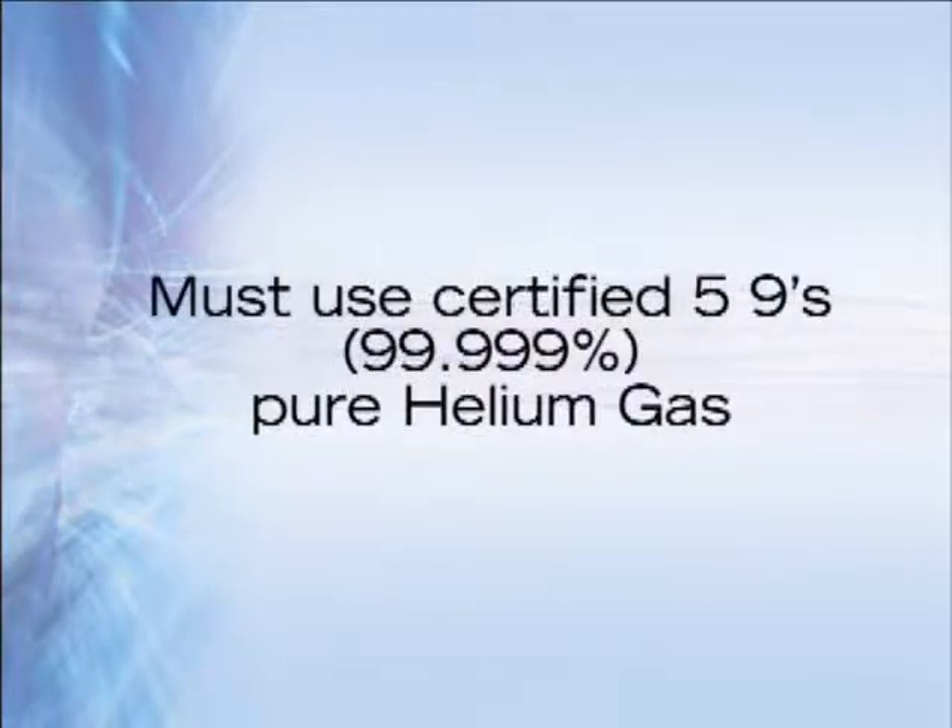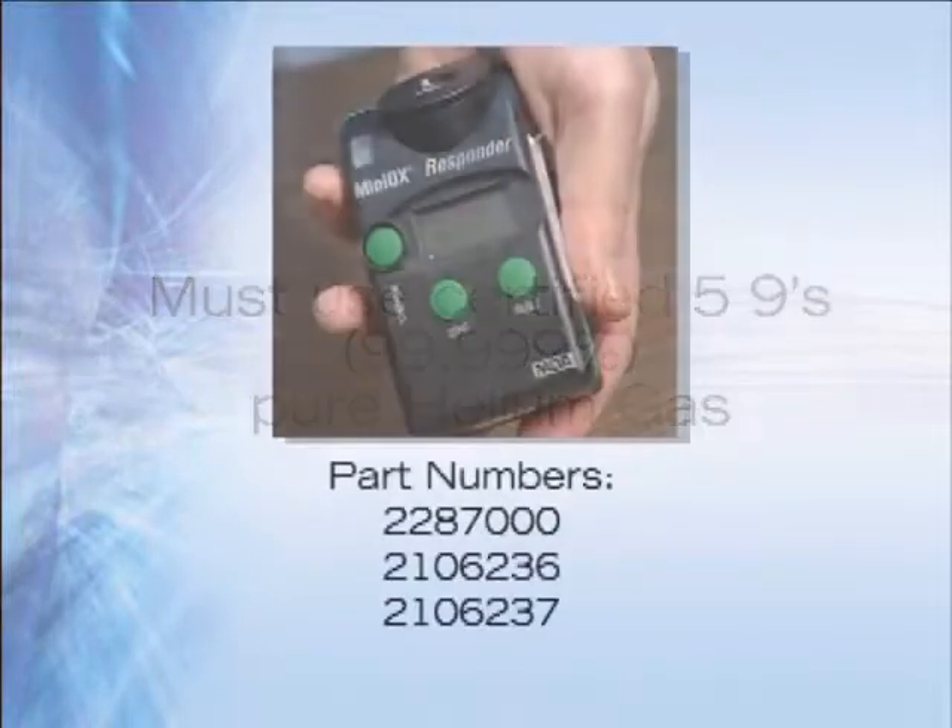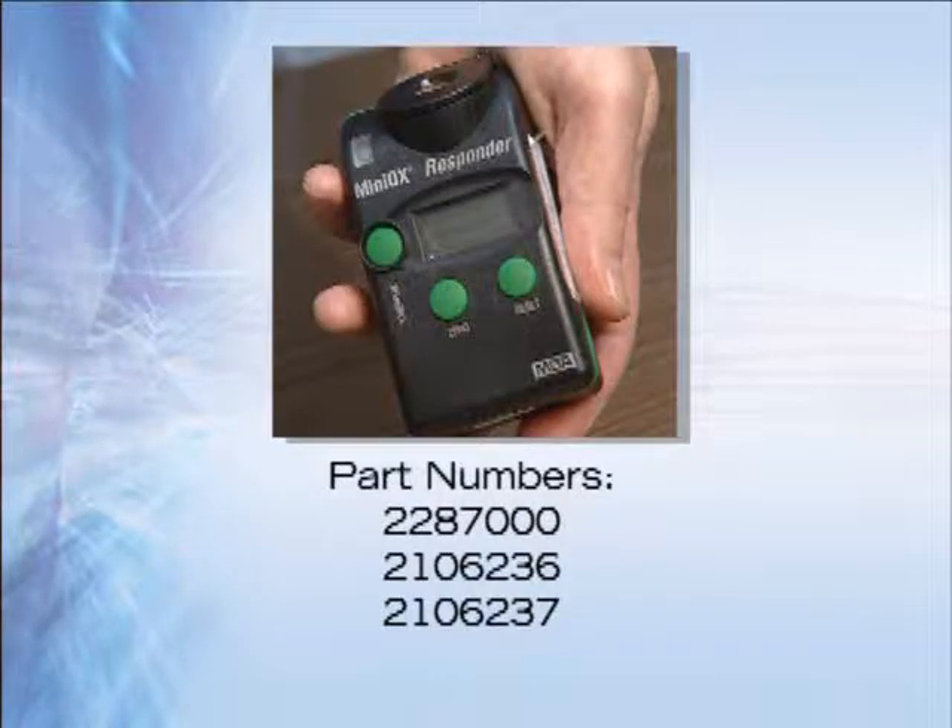These procedures use five nines pure high pressure helium gas. Make sure the helium bottles are properly secured before starting the procedures. The personal oxygen monitor should be worn during this procedure, as helium gas can quickly replace oxygen in a room. Make sure the area is properly ventilated.